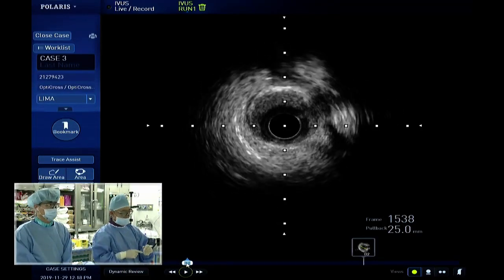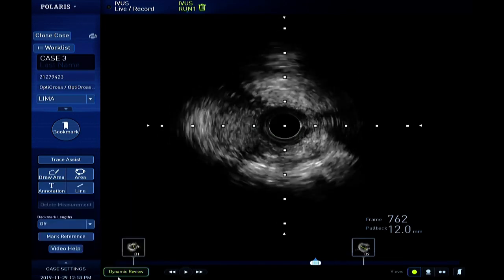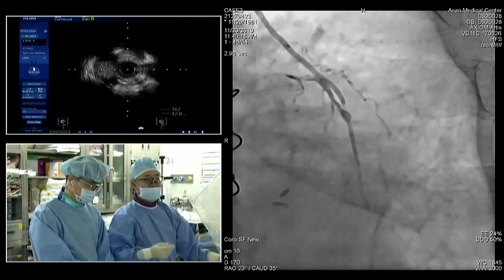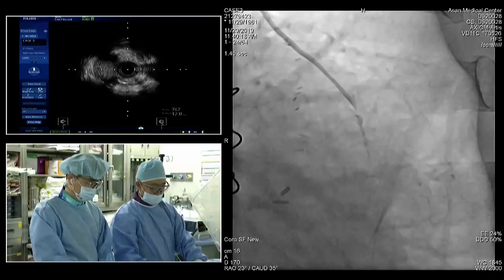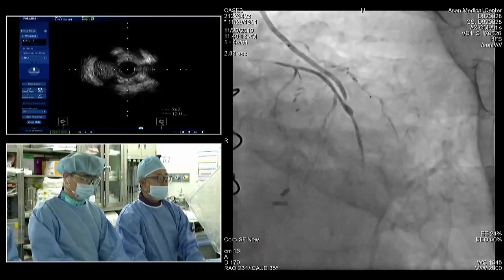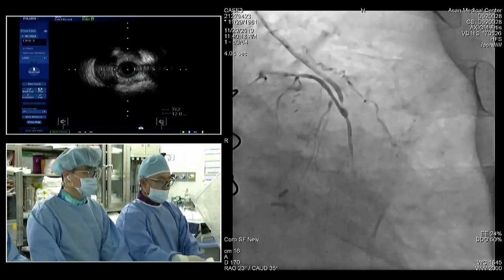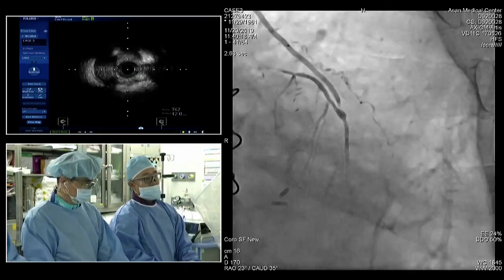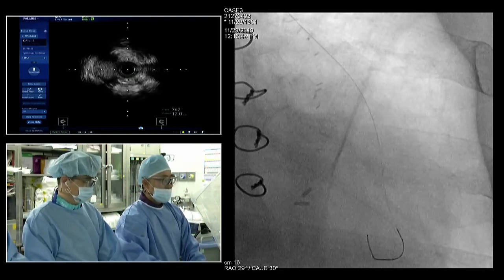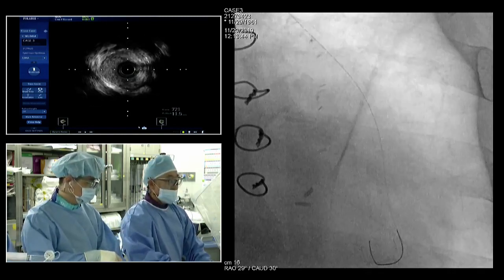Today, via this live case demonstration, my key message is that bypass surgery is not always good, sometimes bad. PCI can sometimes be good. Any questions or comments from the audience? What would be your strategy? I evaluated IVUS of the distal part and the anastomosis part, and as shown in the angiogram, it is very tight. I'm going to do additional PCI to the LAD part.